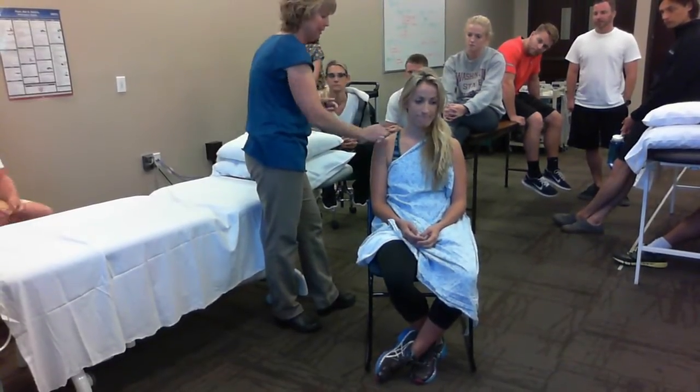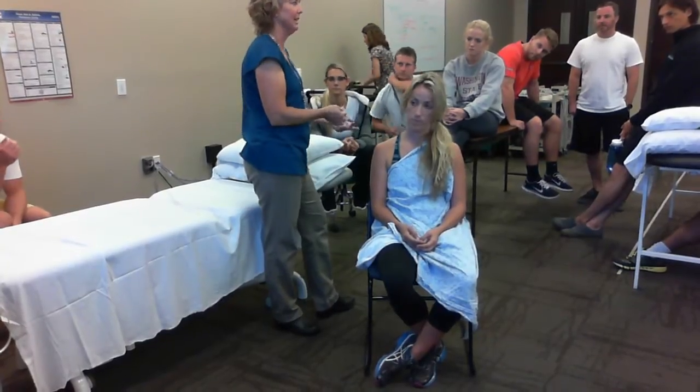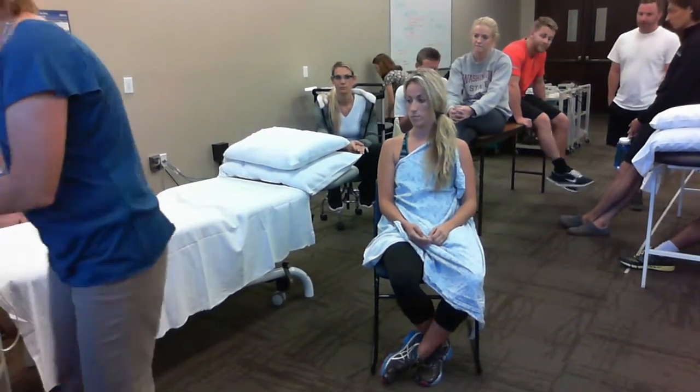Some people say, oh, it's better because the electrode sticks better. Well, of course it's going to stick better, I'm cleaning the skin, but the reason we're cleaning the skin is because of that impedance. That's the real reason: increased impedance.